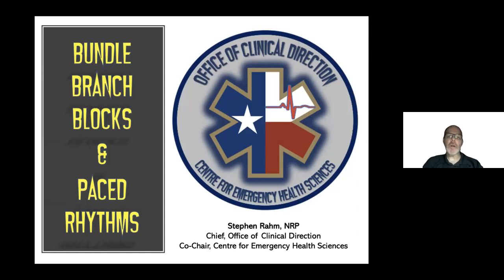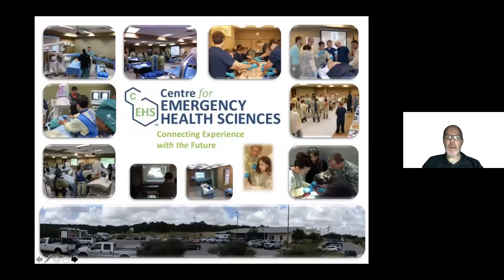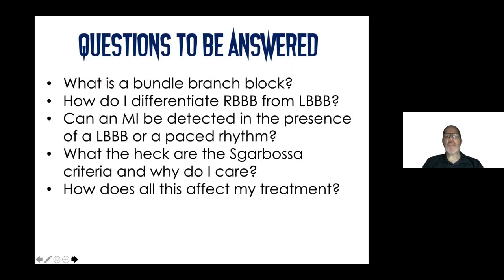But anyway, the topic here is bundle branch blocks and paced rhythms. And I chose this topic because we've had some challenges in the past, and we continue to when we're looking at a 12 lead that shows a bundle branch block or a paced cardiac rhythm, especially when that patient's complaining of chest pain. And we've historically been told that, oh, well, it's a bundle branch block. Specifically, it's a left bundle branch block. You can't diagnose a STEMI, or it's a paced rhythm, so don't look any further. Even the machine will tell you bundle branch block, or it'll tell you paced rhythm, no further analysis.